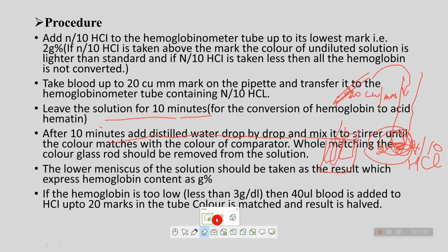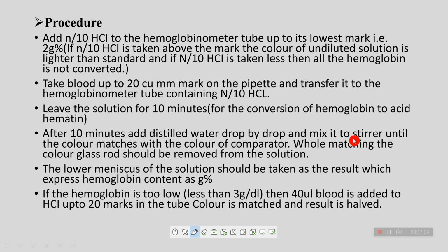Alright, what we have to do, there is a brown glass comparator, right? Here we have to put the hemoglobin tube, and at both sides it has brown glass comparator. So after the 10 minutes we have to insert the hemoglobin tube here.